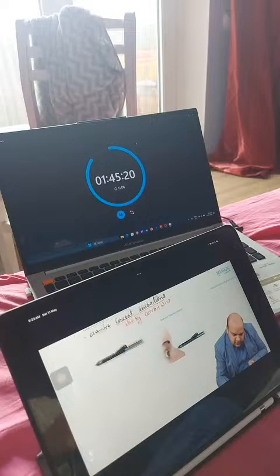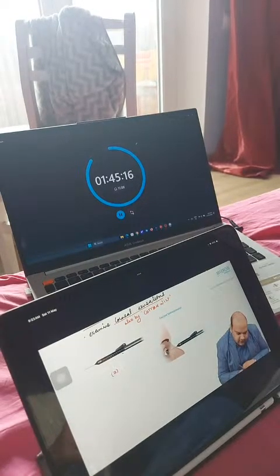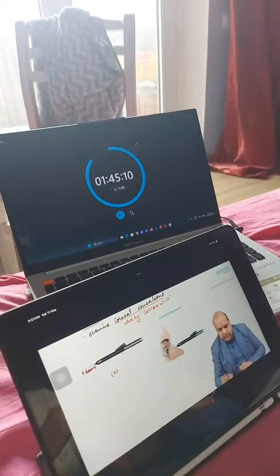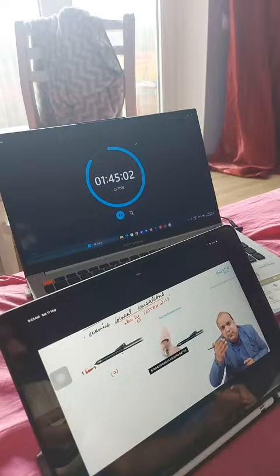Yes? So this instrument, everybody, this image that you see, image A here, is a pen-like instrument with a thin filament which comes out from this. The maximum length of this thin filament is 6 centimeters. The filament will touch the cornea of the patient. We open it completely first to 6 centimeters. We touch the cornea. We see whether the patient is able to feel the sensations or not.